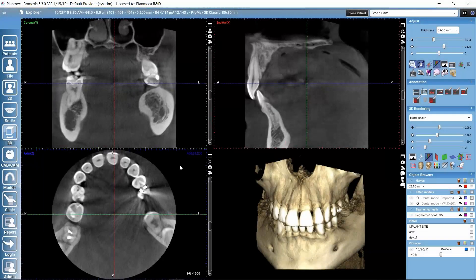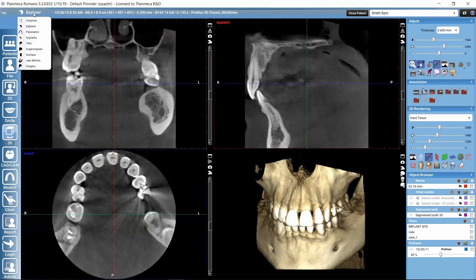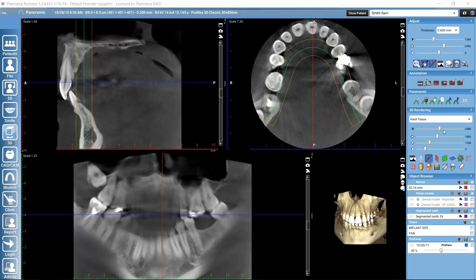In this tutorial, let's focus on the panoramic sub-module of the 3D imaging module of PlanMeca's software. Currently I'm in the Explorer sub-module of the 3D imaging module, which is where the volume gets opened by default after capturing, importing, or opening it from the volumes list. Let's start by navigating to the panoramic sub-module. If we click on top of the Explorer text, we see all the sub-modules available in this license. Let's select panoramic.